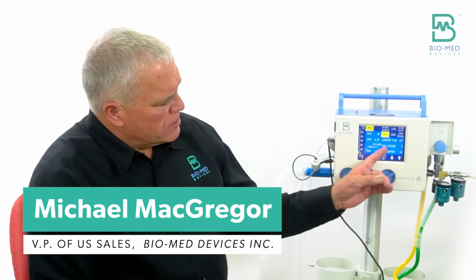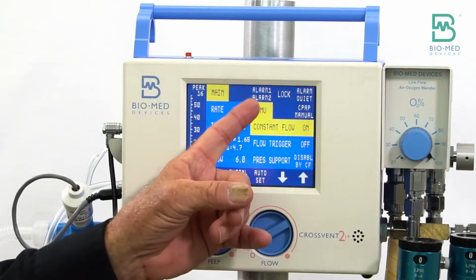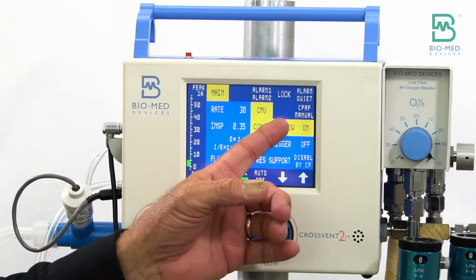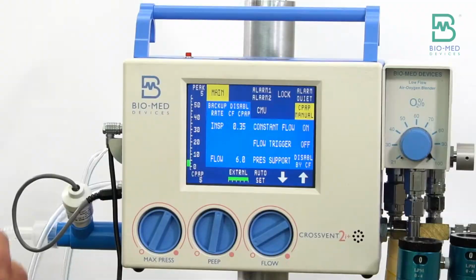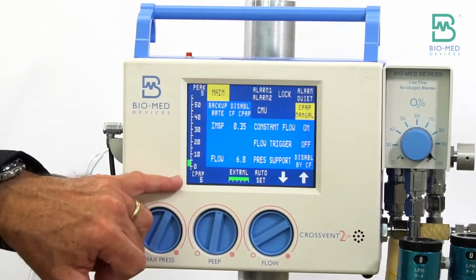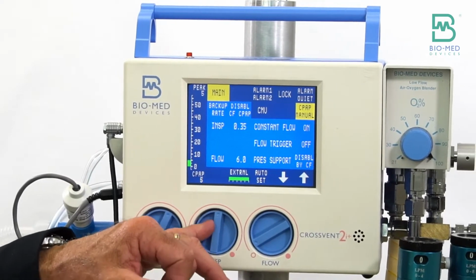Let's talk about some of the different modes that the Crossvent has. When you're in constant flow, you really only have CMV and CPAP. If you're going to use infant nasal CPAP, you want to be in constant flow and choose CPAP, in which case we'll just assume that I have this going to some nasal prongs instead of this test lung. But you would adjust your PEEP level. Now it says CPAP to get the PEEP that you want.